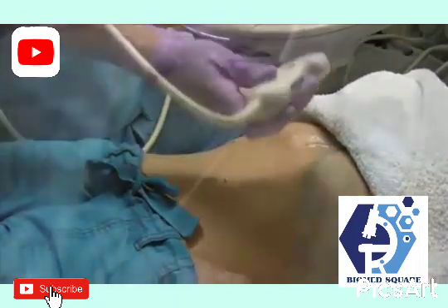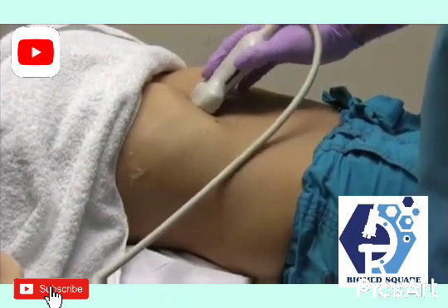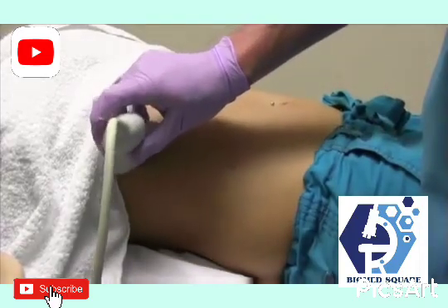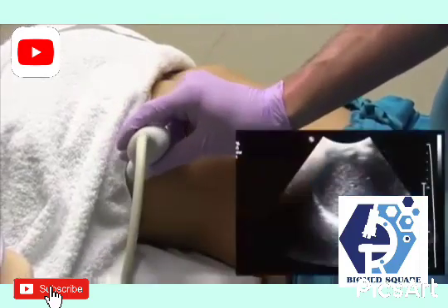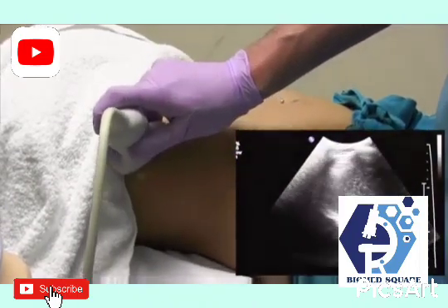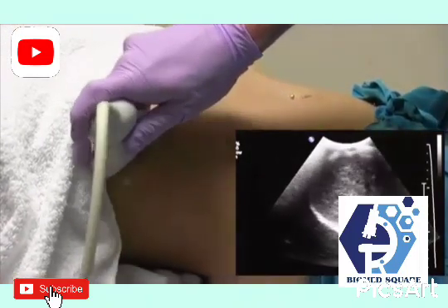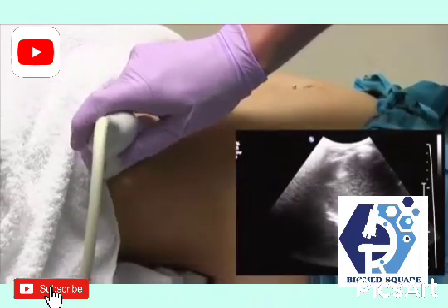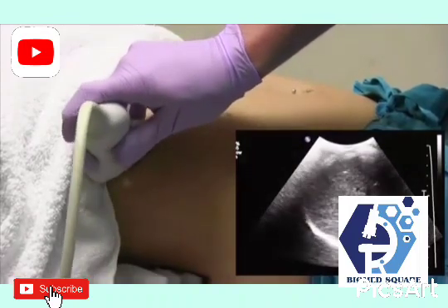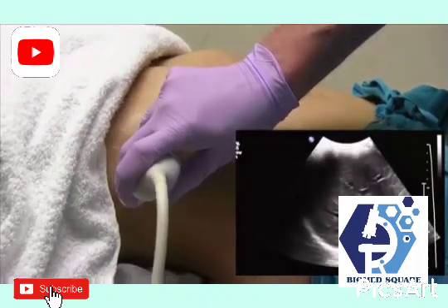Now we're going to go to an intercostal window. So after you finish your transverse sweep subcostal through the right lobe, we're going to move to the intercostal window. And for this window, you're going to want to make sure that your probe is slightly obliqued, because you want to fit in between each one of these rib spaces to get the best view of the liver. And you start again up at the top of the liver, and you sweep through the top rib space here. Next, you come down a rib space, sweep through again.